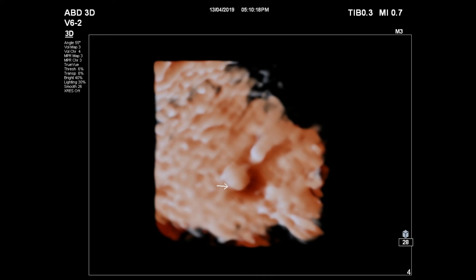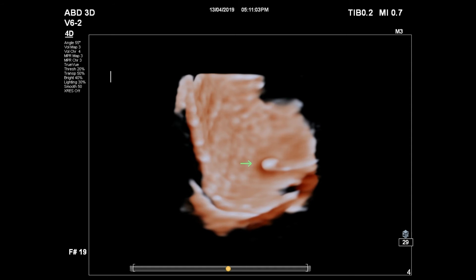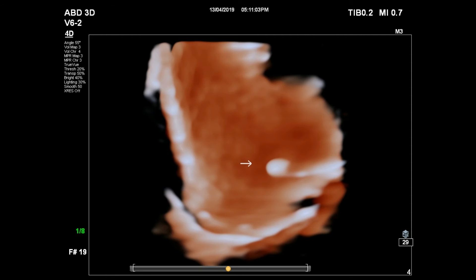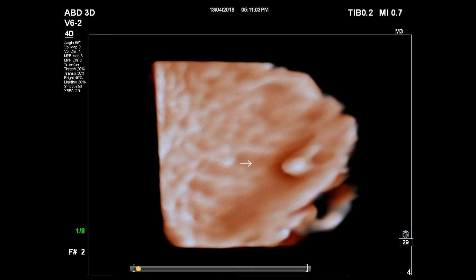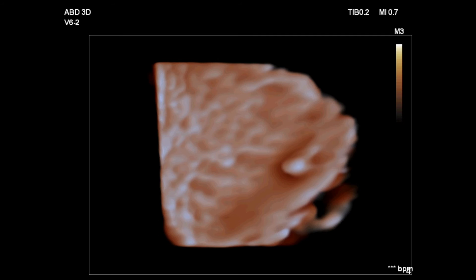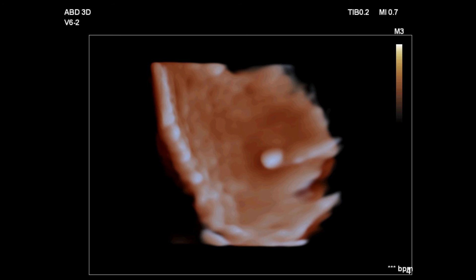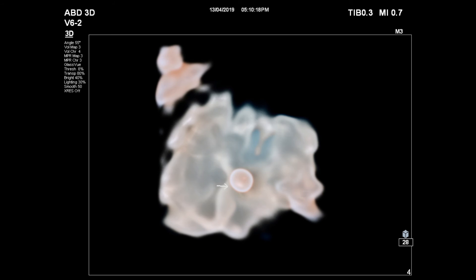Let's see some beautiful 3D images of the calculus. Now check these views on live 3D or 4D ultrasound. Here are some other 3D modes from the Philips machine.